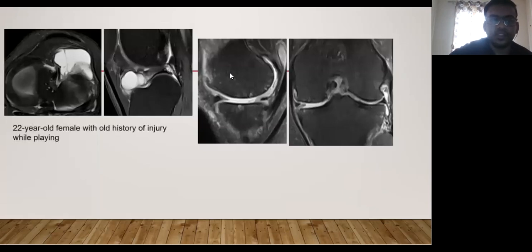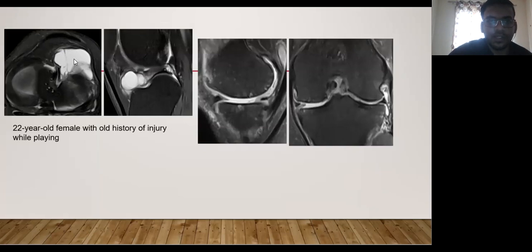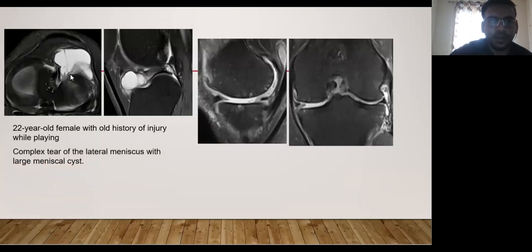Next, regarding complications — this is a case of a 22-year-old female with an old history of injury while playing. On axial and sagittal sequences, a large cystic lesion is evident, appearing hyperintense on PDFS sequences. It is present at the anterior horn and the anterior portion of the body of the lateral meniscus. This cystic lesion shows a few septae, making this a complex meniscal cyst.